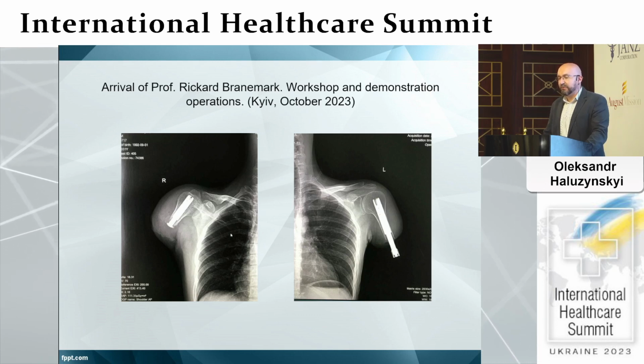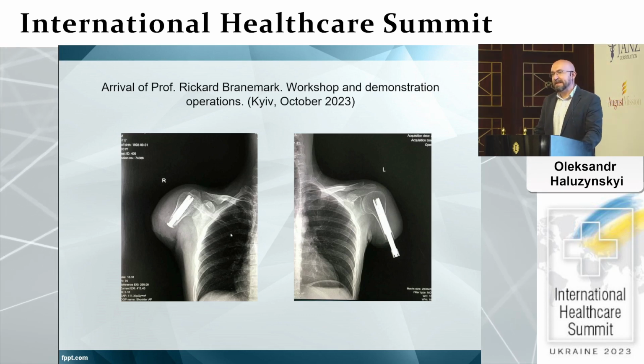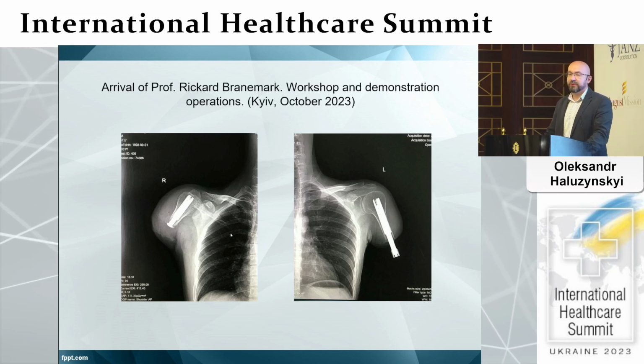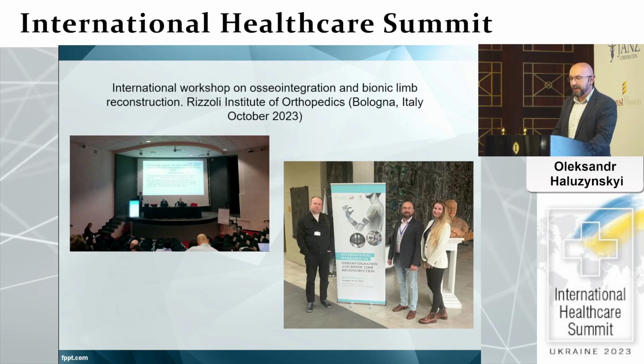And the surgical technique involves two stages. First one to install the implant, and the second stage 3 months later to install the so-called abutment, which is the connection device between the bone implant and the external prosthetic device. And further speaking of osseointegrative devices for different extremities, the bone structure has to be assessed along with the soft tissue status, and sometimes we might consider having both stages performed at the same time. And here you can see the x-rays of one and the same patient who had such dual stage surgery performed at one operation.